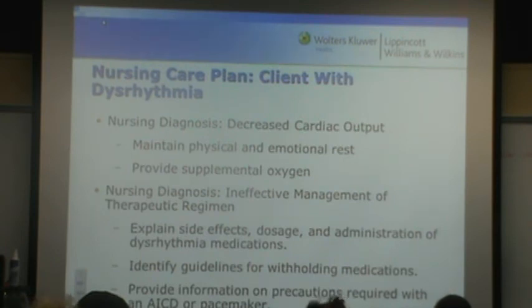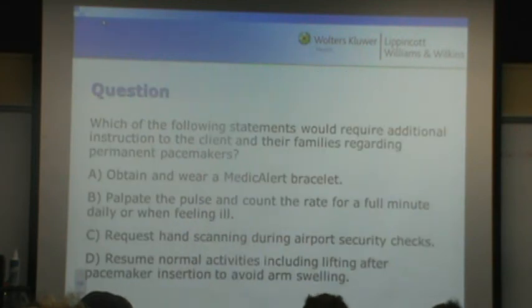And as far as giving patients information about precautions when they have that automatic internal cardiac defibrillator or pacemaker, they will need to be familiar with those. All right, which of the following statements would require additional instruction to the client and their families regarding permanent pacemakers?